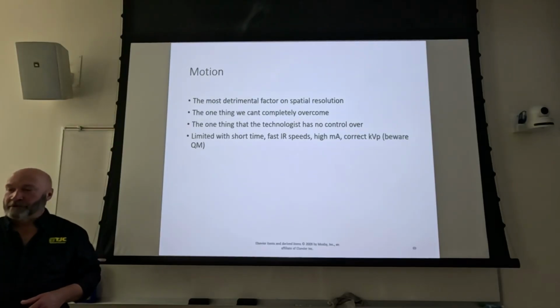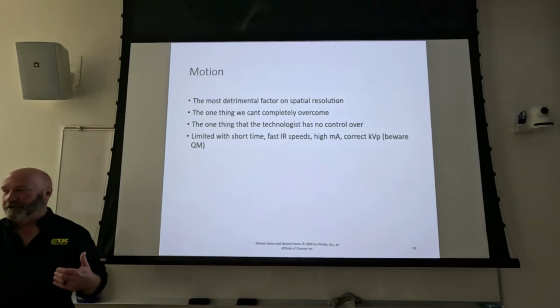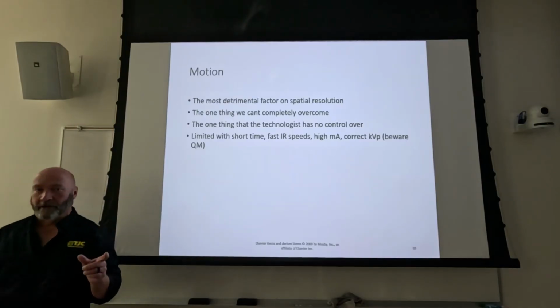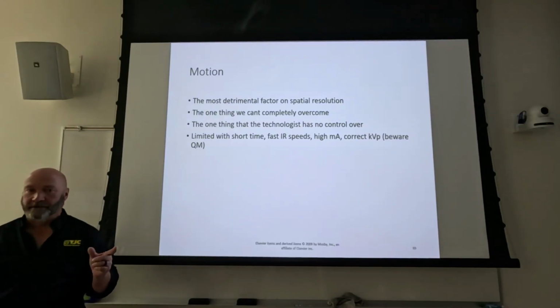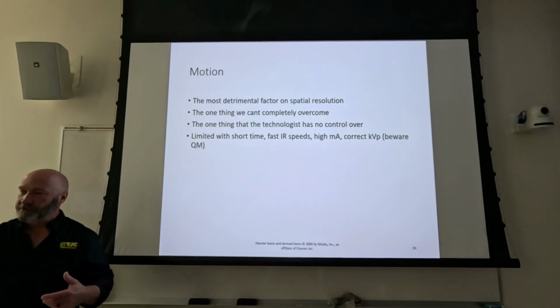But if you're phototiming, you have no idea what kind of technique to set. Primarily you don't have any idea what kind of mAs to set. So you can't really use reciprocity, but you can increase your kVp, and it's your mA for the most part, unless you're using a falling load generator. I'll get you to go back to Bushong and look that up. If you increase your kVp, the mA is fairly well set, so the variable that's going to change is time, right? So overall mAs decreases, but specifically time. So you increase your kVp and your phototimer is going to shut off quicker.